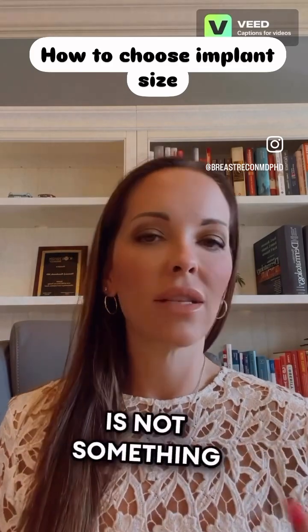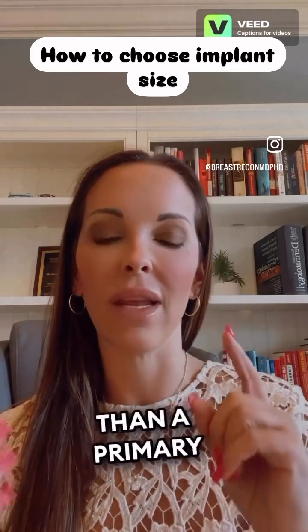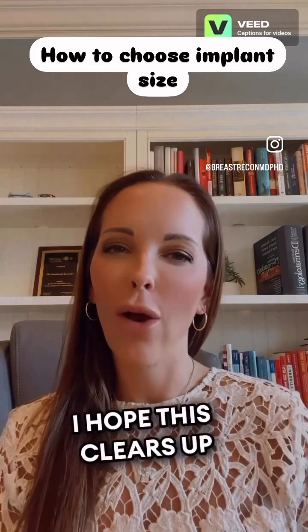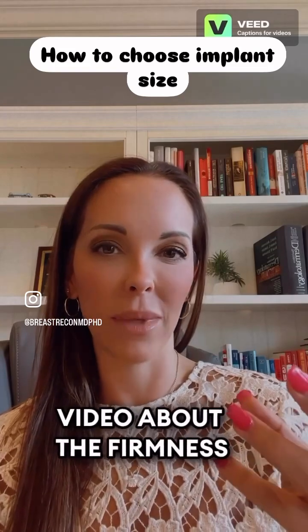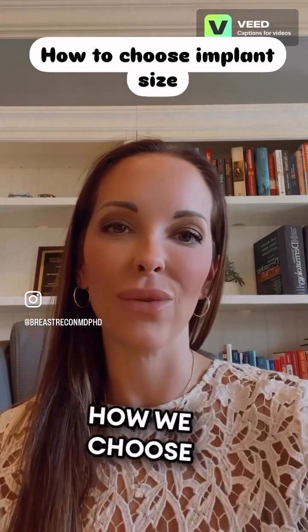So projection is not something you choose, which is very different than a primary breast augmentation. I hope this clears up the confusion. We'll talk in another video about the firmness of implants, but this is how we choose implant size.